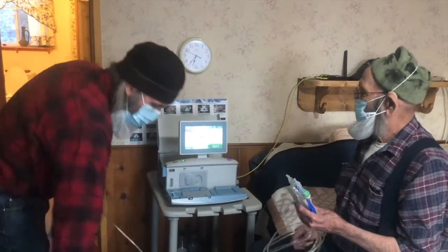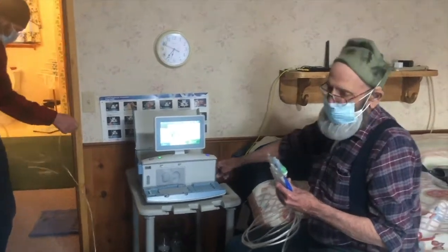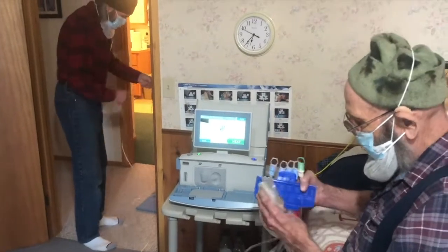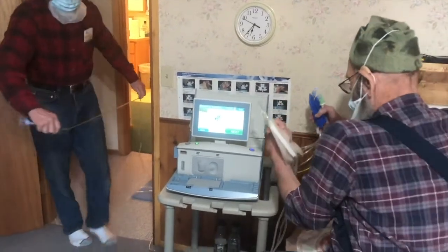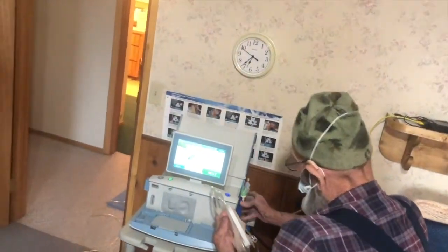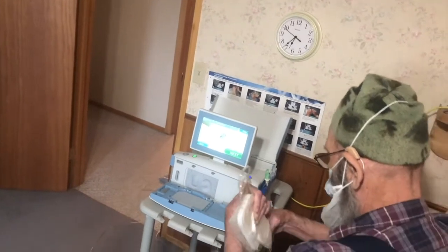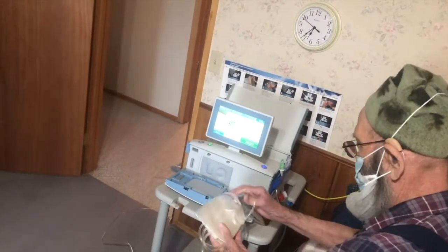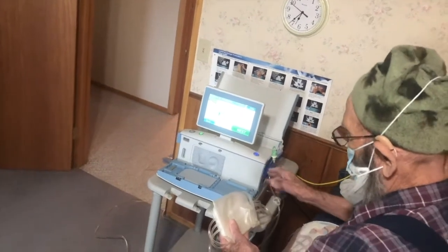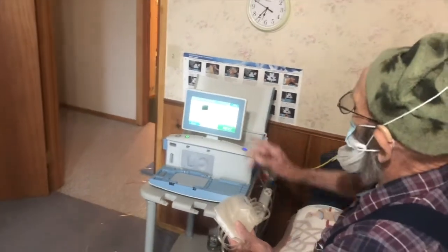Insert the line organizer in the clip on the right side of the device. This machine has a little clip over here on the side. You just take this thing and open it up and stick the lines underneath the table, and then that clips right on the side just like that. Then you got your cassette here. You want to turn that thing around and make sure nothing gets kinked in there, and go to the next one.